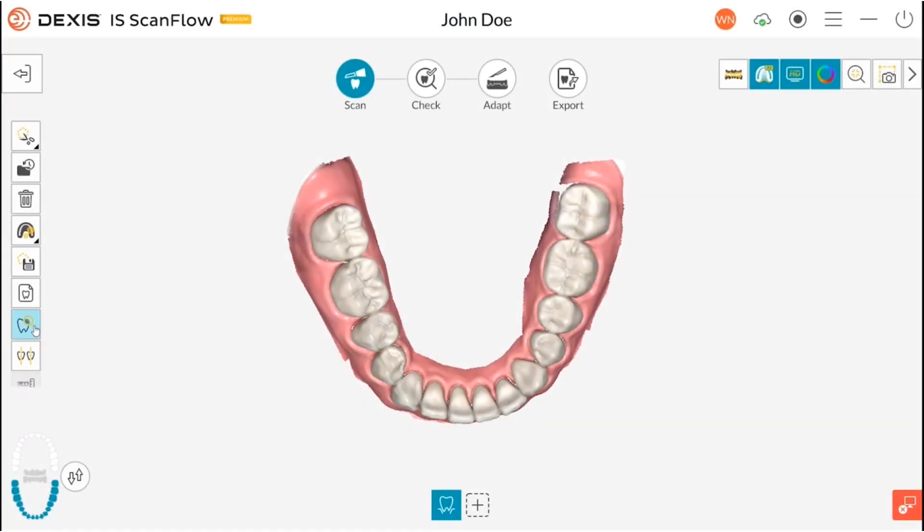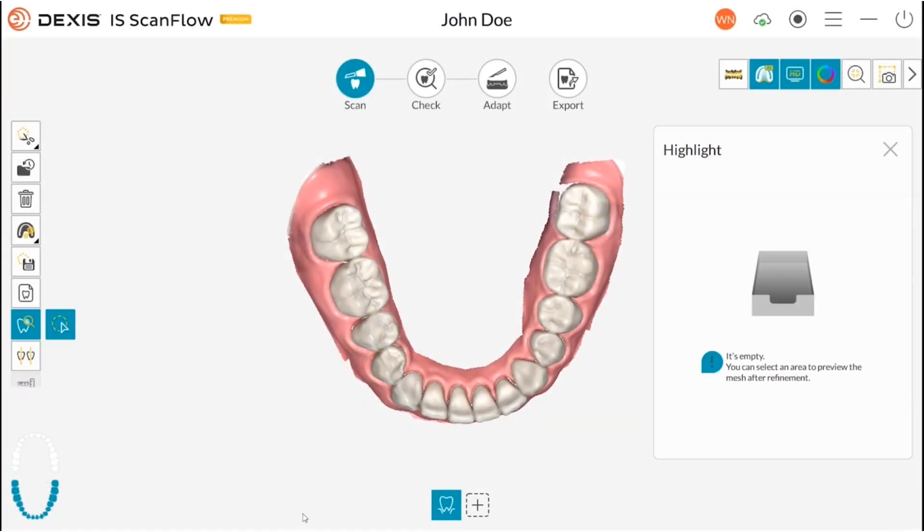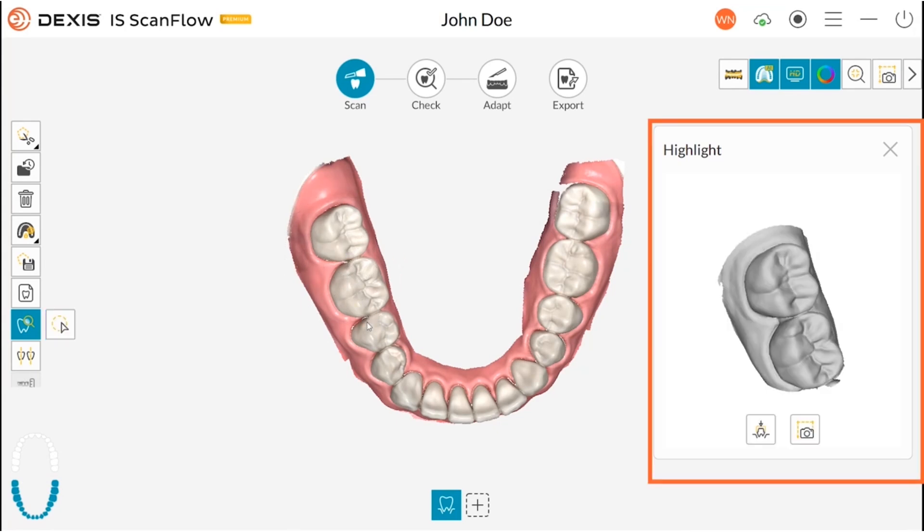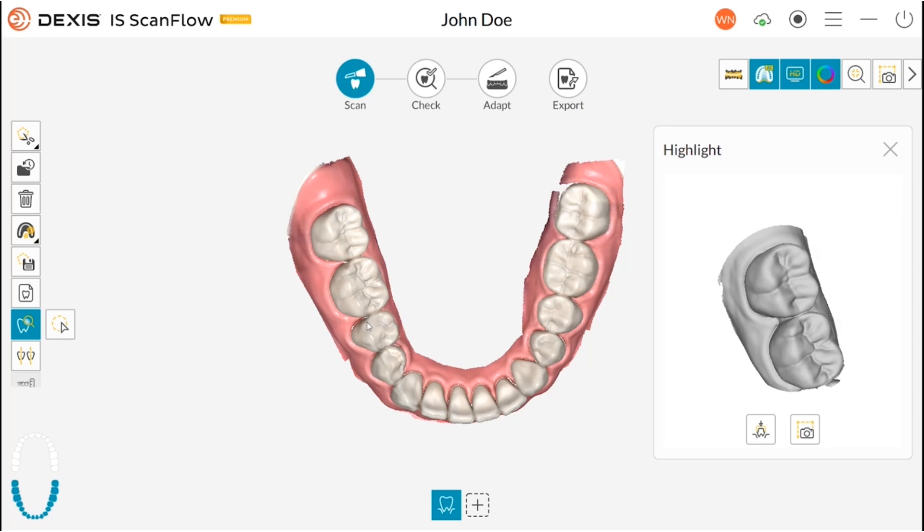The Highlight Tool. Utilize the highlight feature to enhance the specific area of interest, such as the preparation zone, in high resolution. This allows for a rapid assessment of mesh quality within seconds, bypassing the extensive refining process and consequently decreasing the time spent in the chair should a re-scan be necessary.